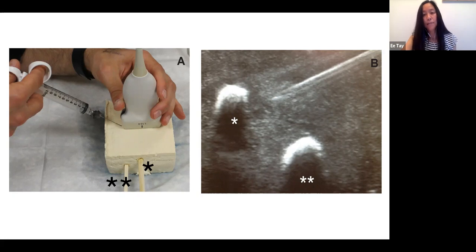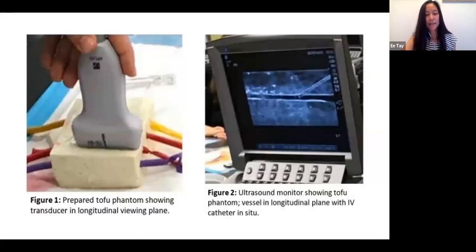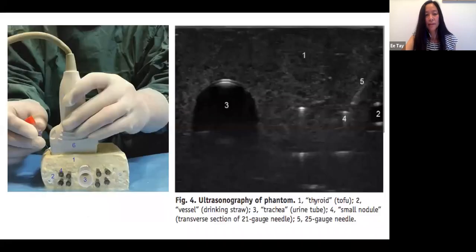And here on the B, the right side, you see the needle actually going in to do venipuncture. And so here again, it actually works quite well. I've done this a couple of times. Instead of the Penrose on the left side, they actually use the balloons that they use for balloon animals, and it works just as well. So with tofu, it's pretty flexible.